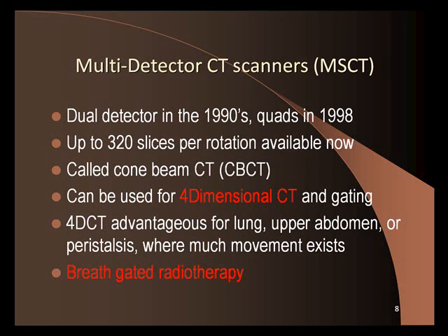Okay. I'm just giving you guys an overview. I don't want to go into too much detail because you'll be learning about CT scanners in your diagnostic course. This is just an overview since we're talking about CT simulators.